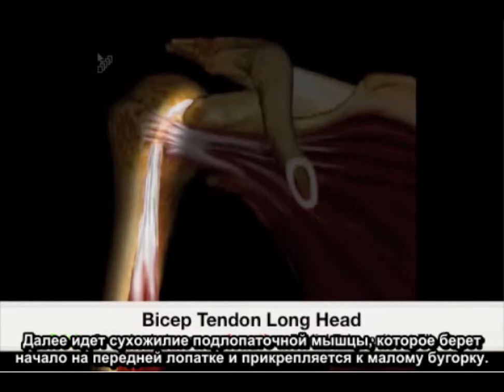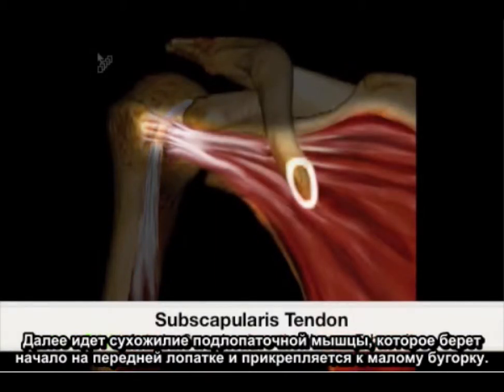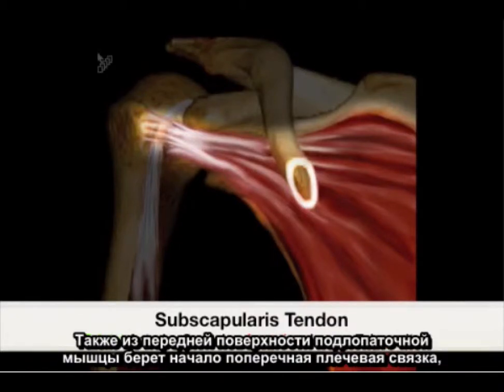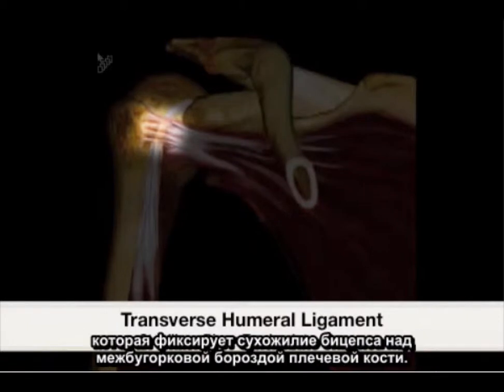Next is the subscapularis tendon, which originates at the anterior scapula and inserts to the lesser tuberosity. Also originating from the anterior surface of the subscapularis is the transverse humeral ligament, which anchors the bicep tendon in place over the bicipital groove.